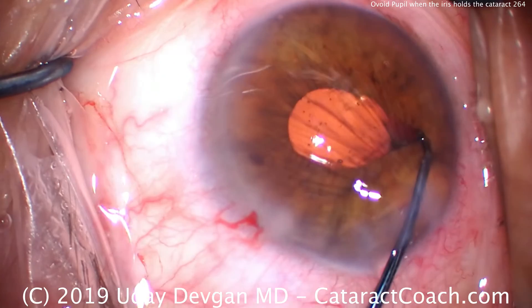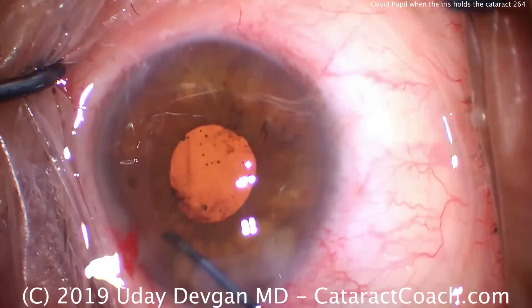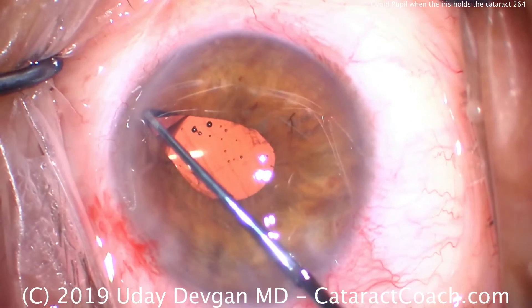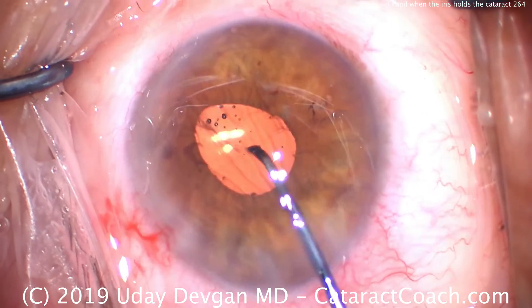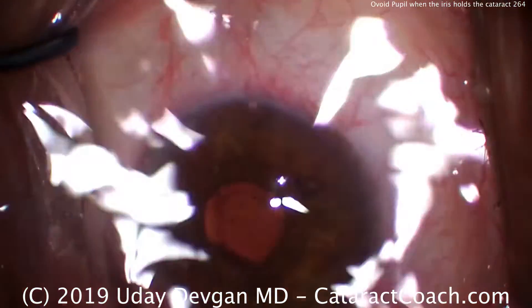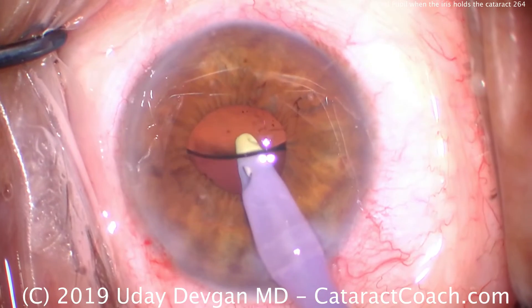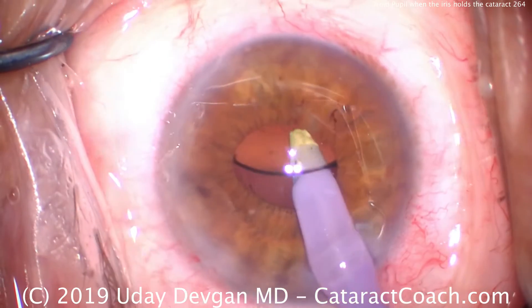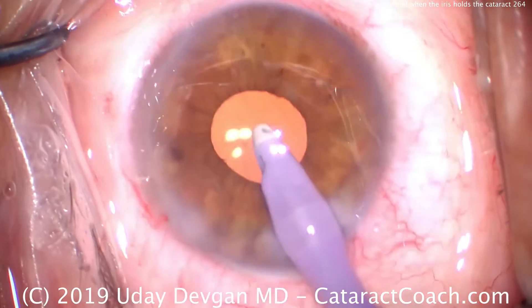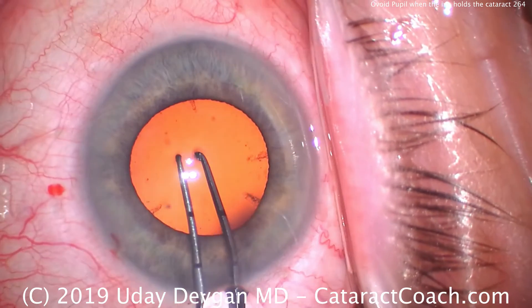There's no cortex. You can do it all around — that looks good too. There's the haptic-optic junction; you can check sub-incisionally, check to this side, and you'll get a nice view all around. We are sure the lens is completely in the capsular bag and there is no retained lens material. Now just take out the viscoelastic with the IA probe. We can go under the lens as well and remove the viscoelastic to complete the case. You can also use the chopper again during this phase if you think the lens has moved, just to lift the iris to make sure.